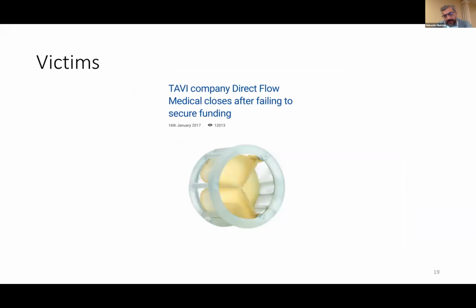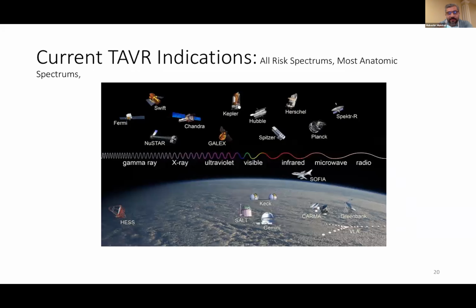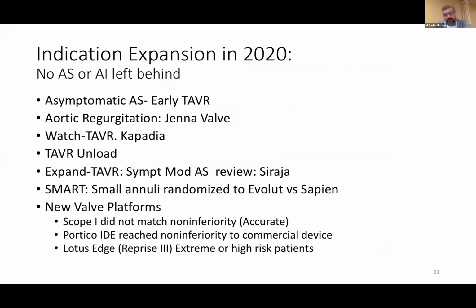Don't forget some of the victims of the TAVR story. Everybody remembers Direct Flow Medical. I know seeing Samir in some of those meetings when we discussed this platform. So currently TAVR is approved for basically every indication under the sun with multiple different devices. But TAVR obviously will continue its meteoric rise with all the trials that are ongoing. Some of them were mentioned during this forum, like the TAVR UNLOAD, WATCH-TAVR that Samir is leading, JenaValve.